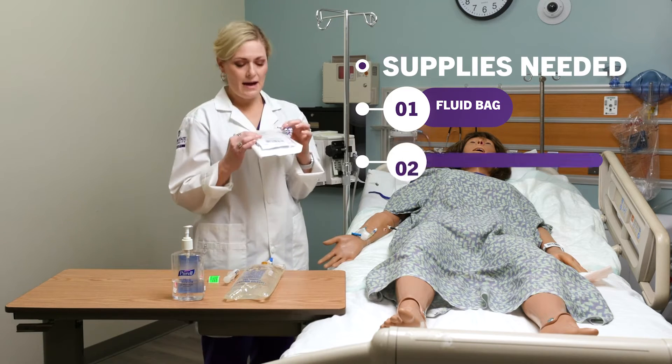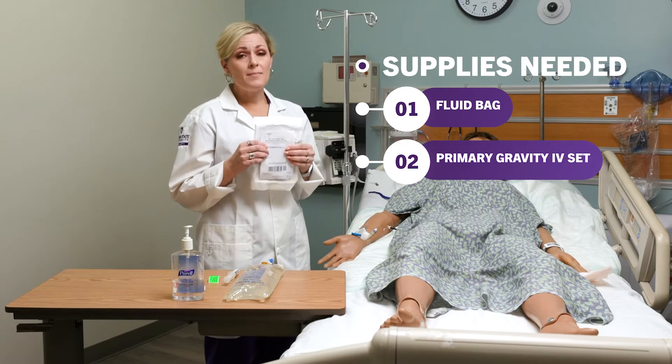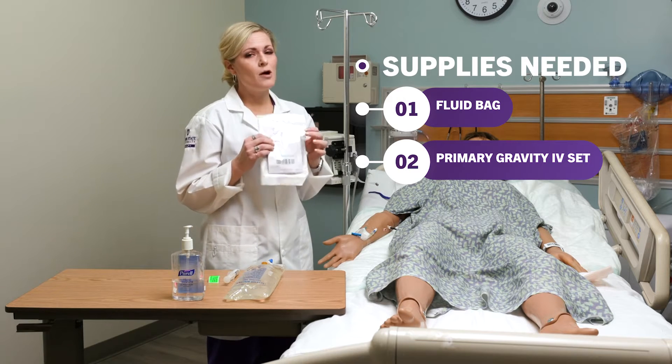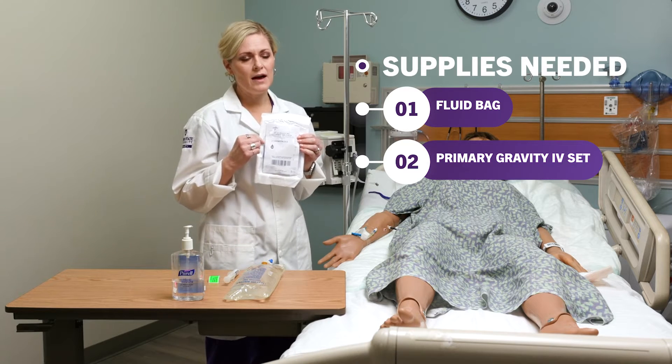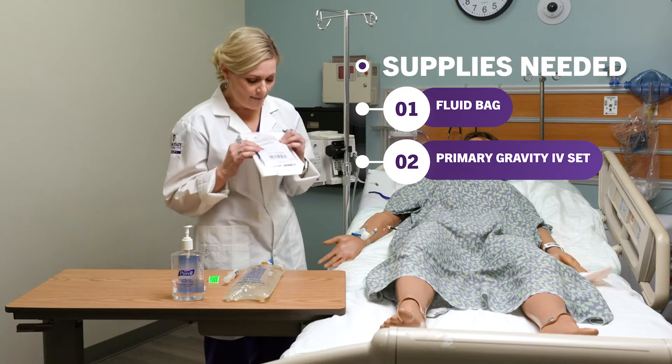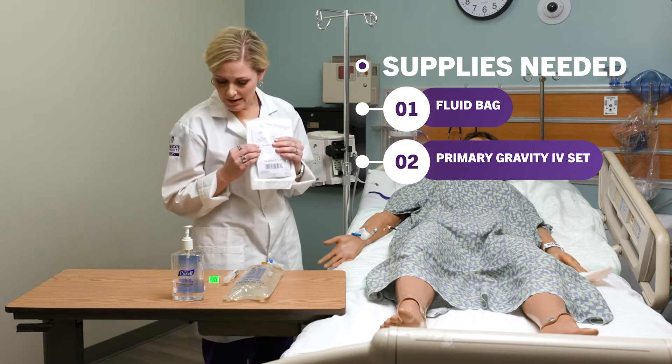This is an IV gravity set, or a primary line. If you're using a pump — which we're not going to use in this video — your pump will have specific tubing for that pump. But we're just using a generic primary tubing.